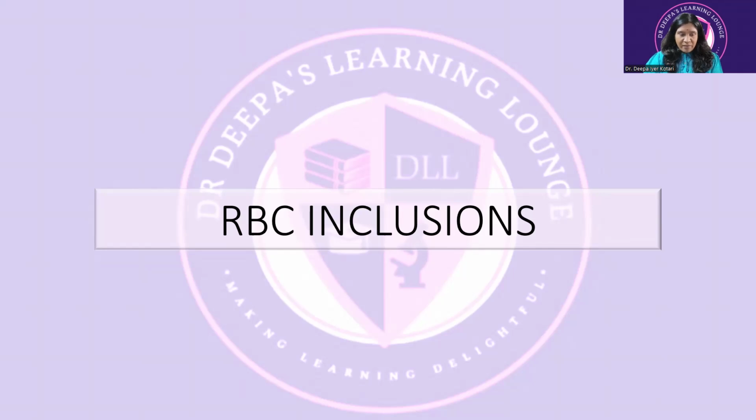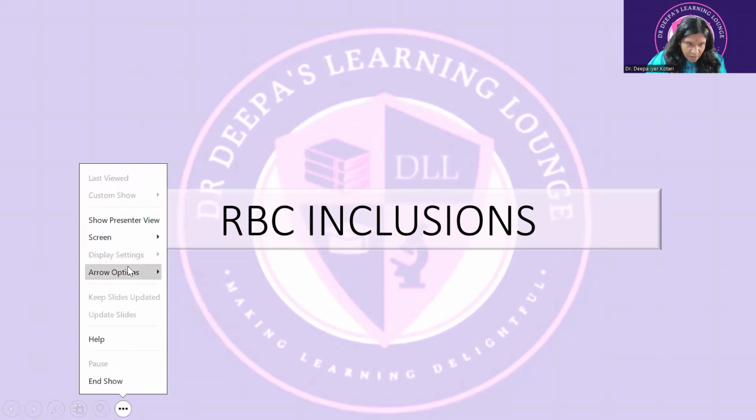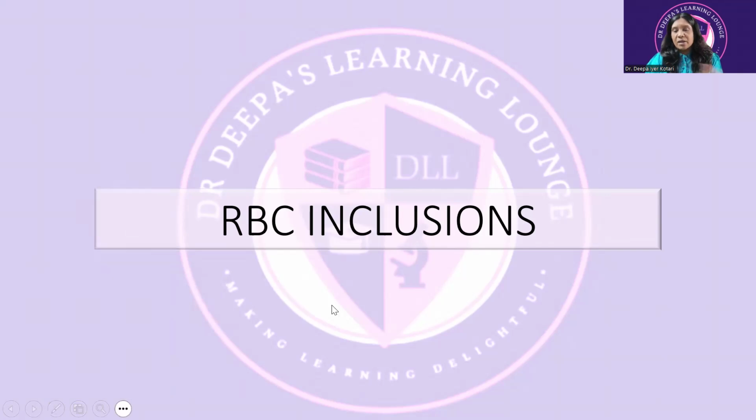Primarily, when you're looking at RBC inclusions, knowing about them is also of great diagnostic importance, because you will be missing a lot of diagnoses if you do not understand the difference between, let's say, Heinz body, Pappenheimer body, or any scenario in which you need to do a supravital stain. So these are things that you have to know.